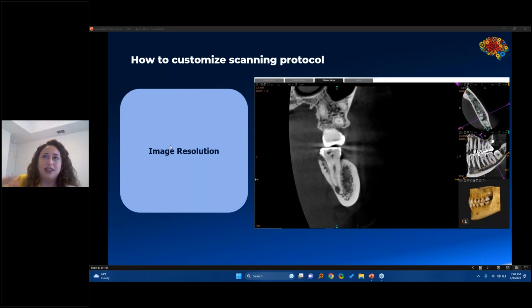And I know that the ADA has been working on a guide to implement CBCT more in offices. The last I've heard about this was a few months ago. But again, I think this is more of a political issue rather than a reason behind cone beams not being safe.